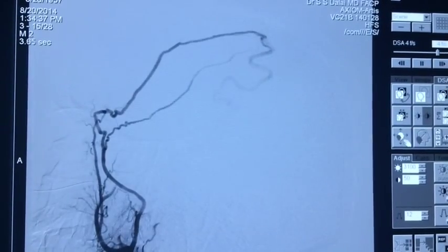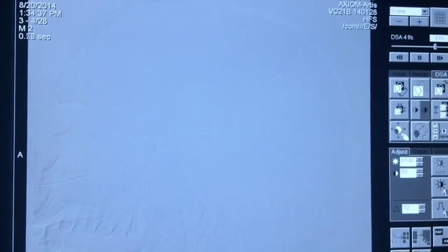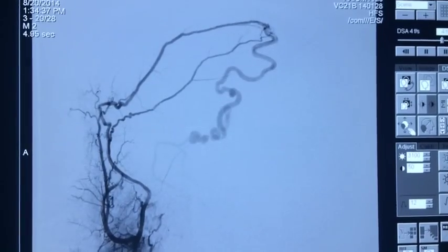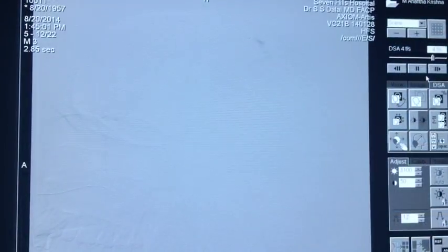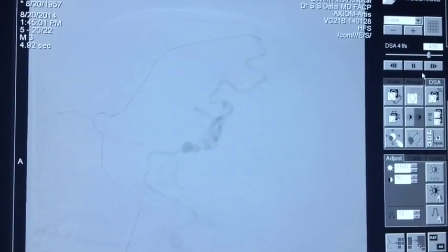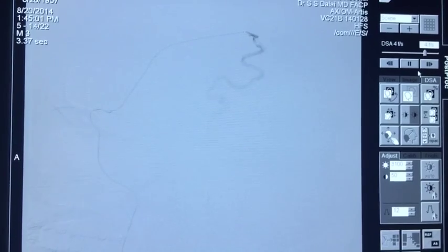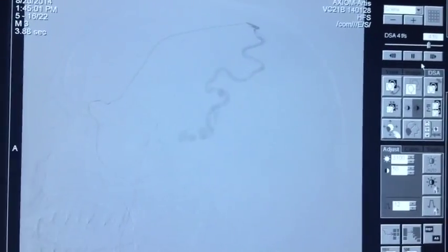We chose Marathon and Magic as a microcatheter and microwire with a 6F guiding catheter into the external carotid artery. We injected Onyx to get rid of the fistula, treating part of the vein and part of the artery. This is the microcatheter run which is showing absolutely good position in the fistula. Once we achieved this position, we inject normal saline DMSO followed by Onyx.